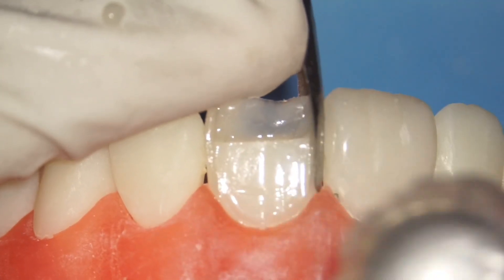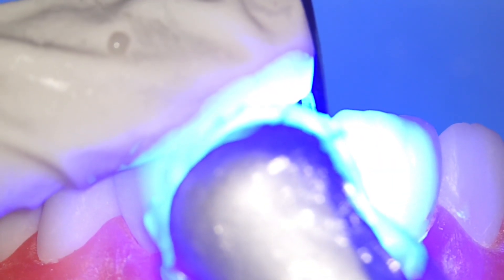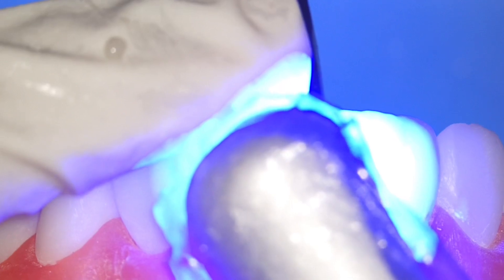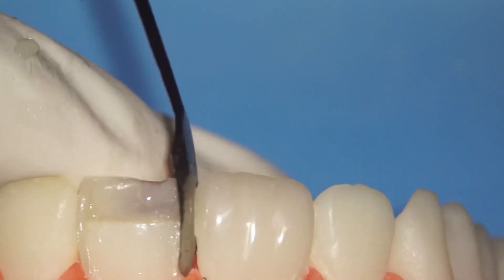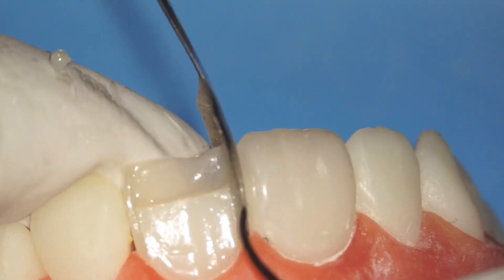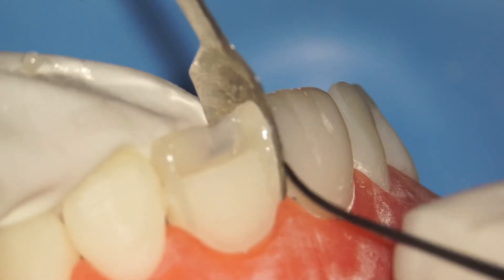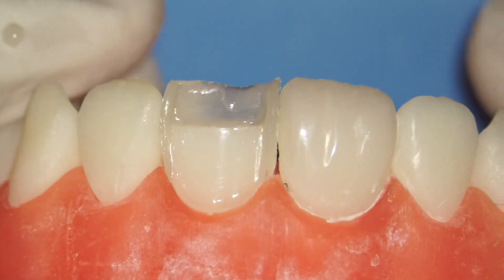When ready, cure the mesial wall. Once cured, separate the matrix carefully and remove it. This step is very important — separating the matrix carefully so you don't pull off your mesial or distal wall together with the matrix band. It can be very tight, so take care not to lose all your hard work.